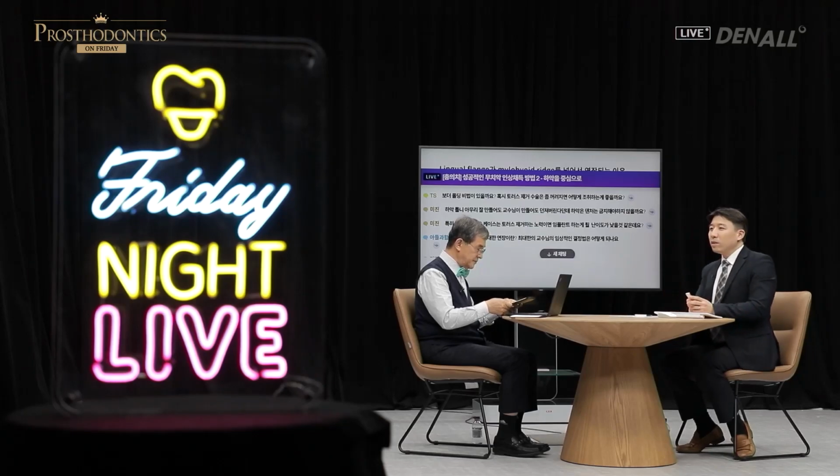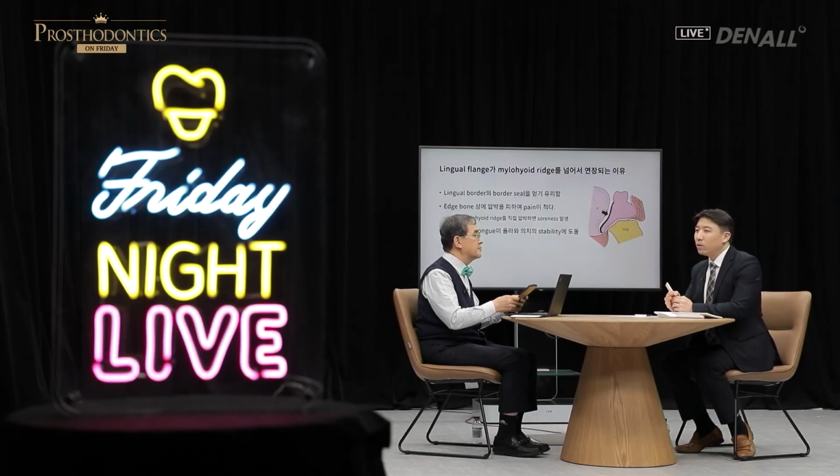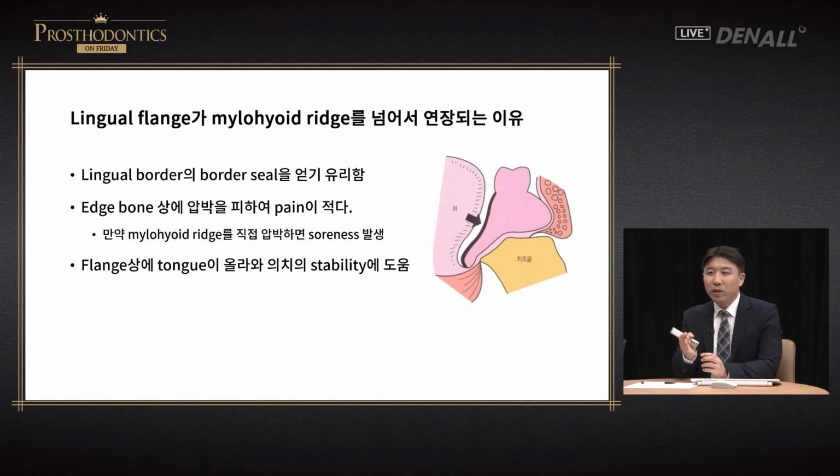Up until now, we have discussed about how we need to extend 4 to 6 millimeters beyond the mylohyoid ridge. I'm going to talk about the reason in more detail. This was addressed briefly before. This is the tongue area. There's a bit of contour.